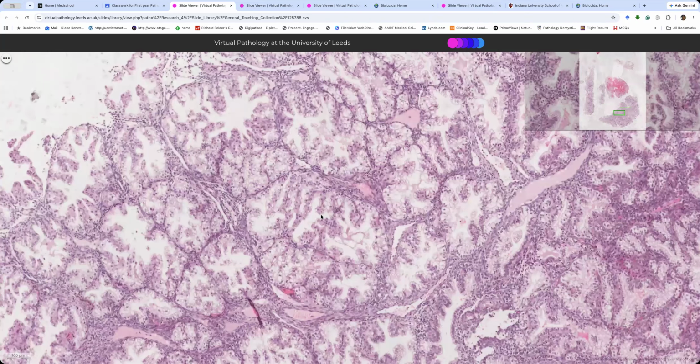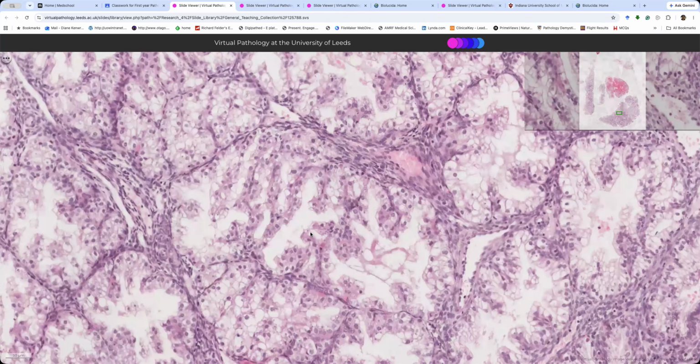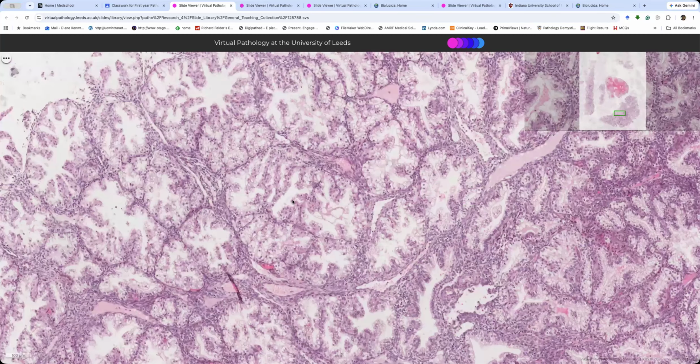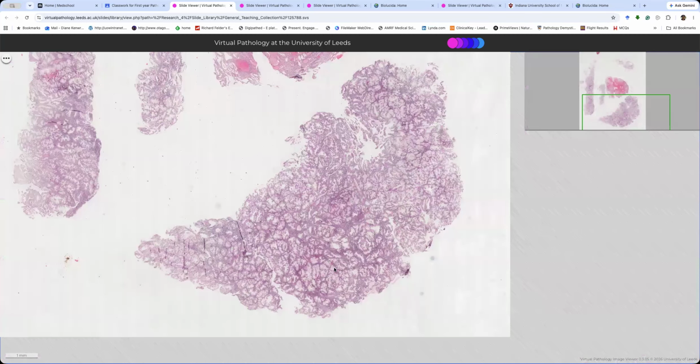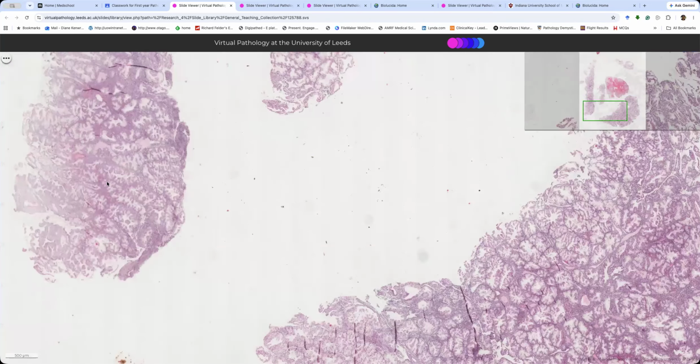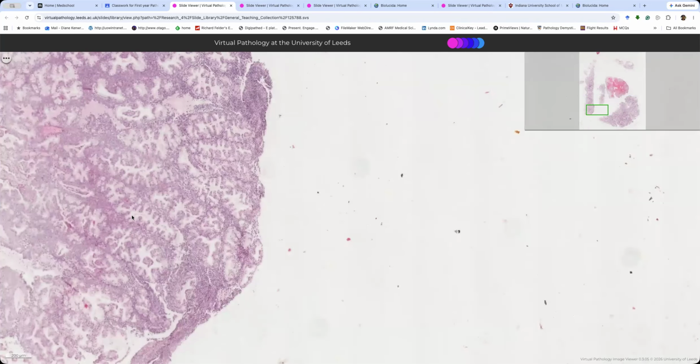This is the Arias-Stella phenomenon that is present during pregnancy, but can also occur during high dose exogenous progesterone. Okay, so the glands are hypersecretory. They are crowded, but crowded glands in secretory phase is okay. We don't diagnose hyperplasia on them. They are super, super corrugated. Look at them here.